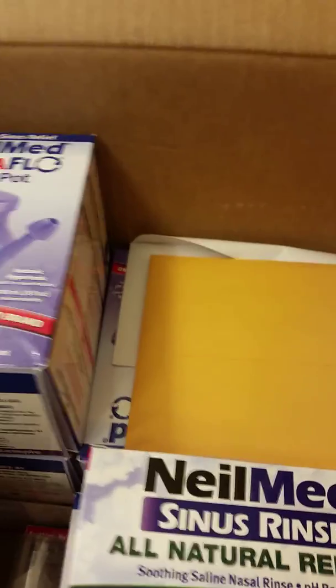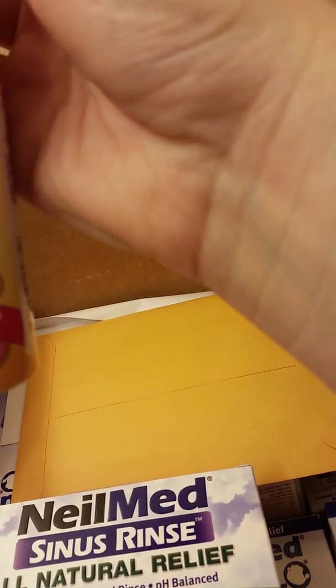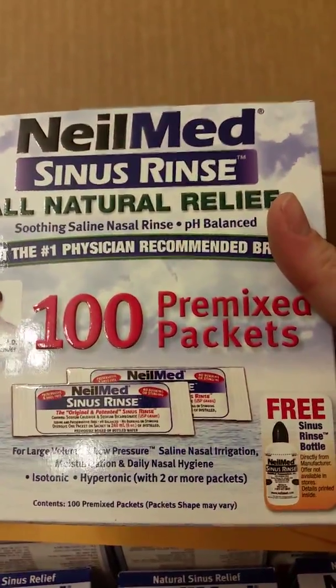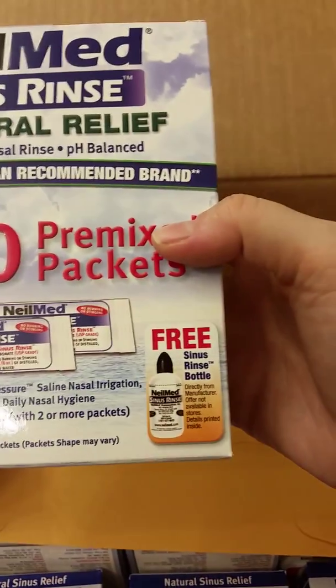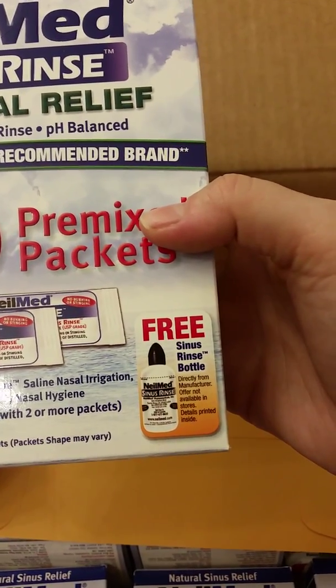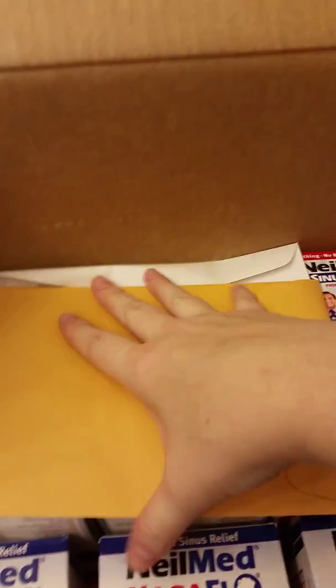Inside I have ten of these neti pots. There are four of the Pediamist saline spray — this saline spray right here. There is one of the hundred-pack pre-mix packets, and I guess a free sinus bottle. I think you have to order that maybe — I don't know, I don't need it because I've got plenty.